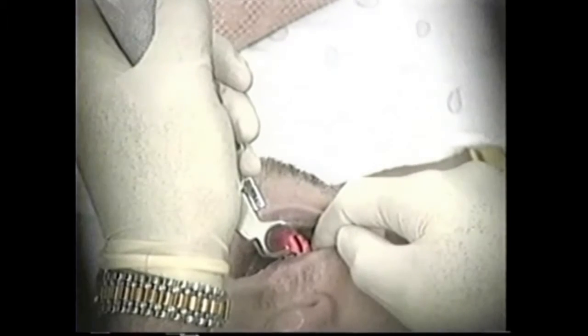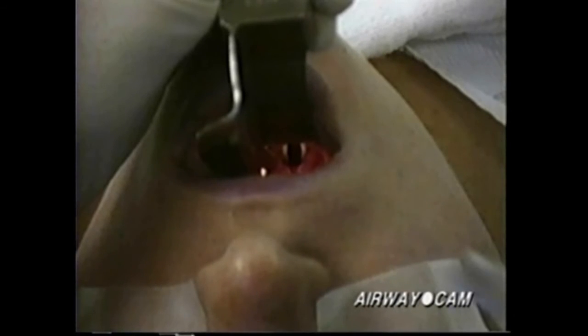Within the larynx, note the false vocal cords, also known as the vestibular folds. The true vocal cords, or vocal ligaments, are white and have a vertical orientation during direct laryngoscopy, which is exaggerated by traction on the laryngoscope blade. The glottic opening widens during inspiration. Depending on the muscular tone of the patient and on the amount of traction on the laryngoscope, the glottic opening during laryngoscopy may be a small vertical slit or have a wide rhomboid shape.